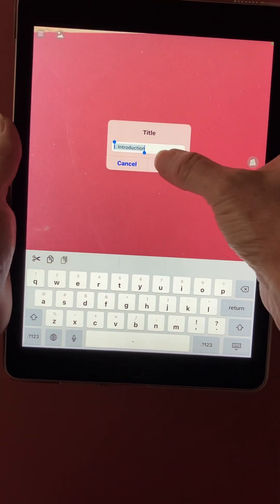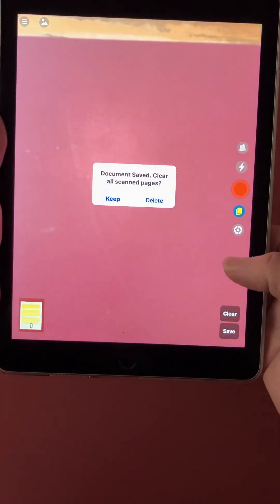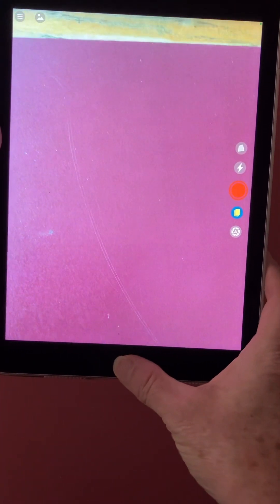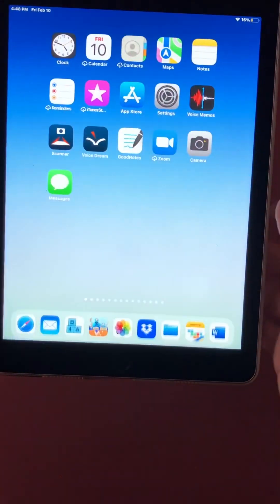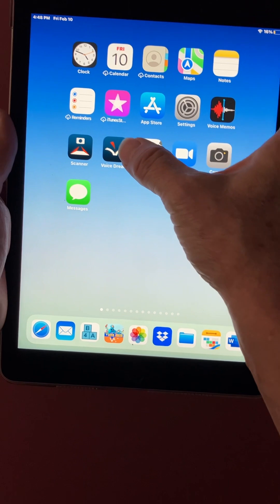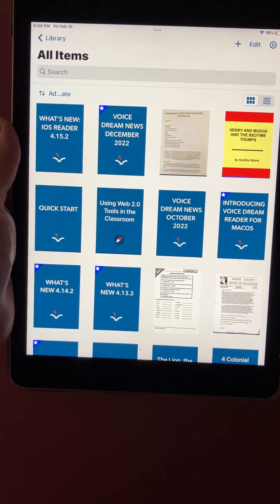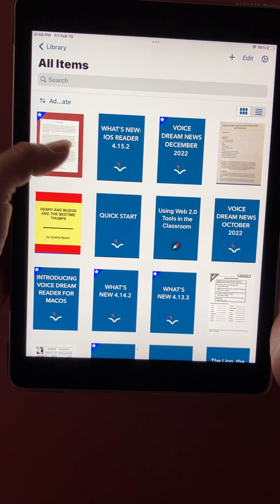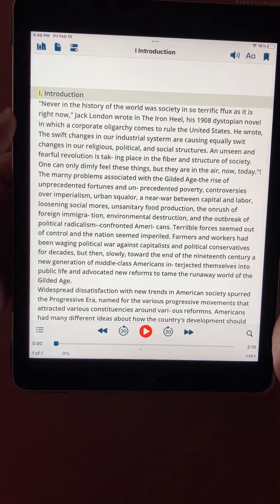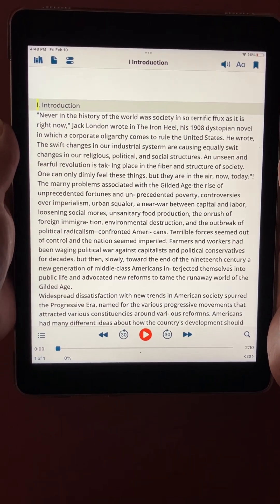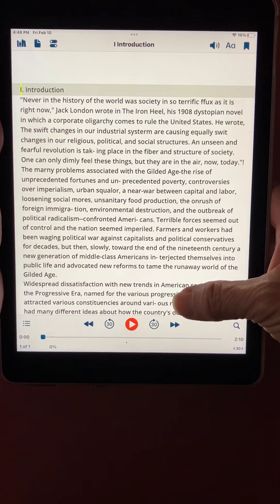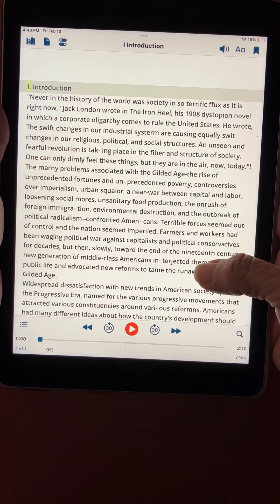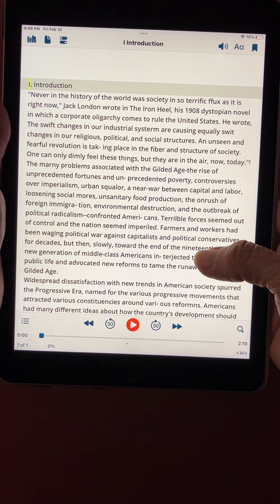I need to title it. I'll hit okay and then the document's been saved. I can clear the page and go out of the Voice Dream Scanner app and open up Voice Dream Reader. It opened up to my library page and that document popped up in my library, so when I tap it I'm seeing it on the screen and it's in the plain text view.